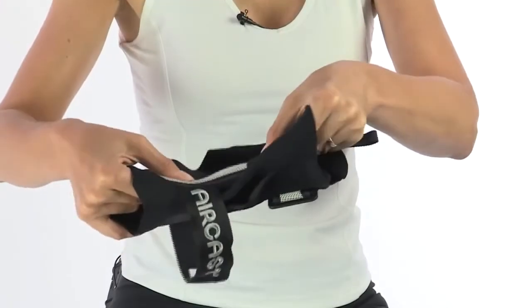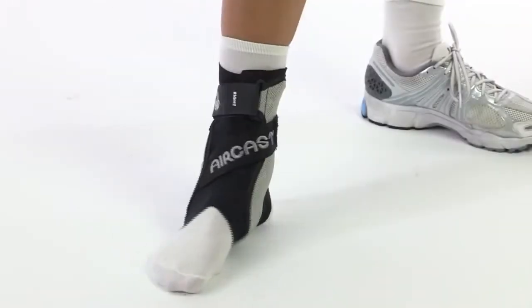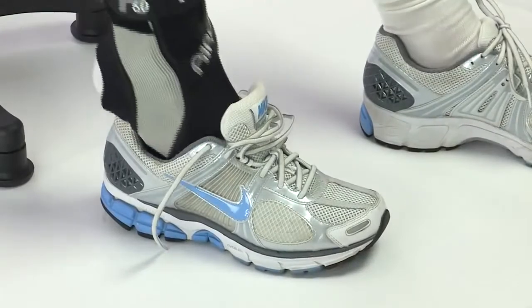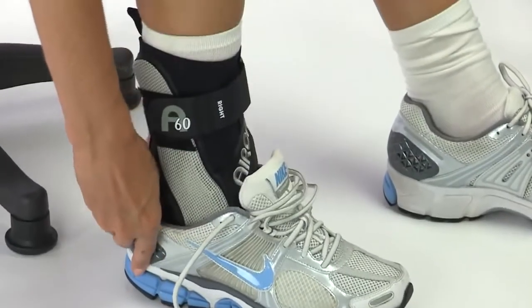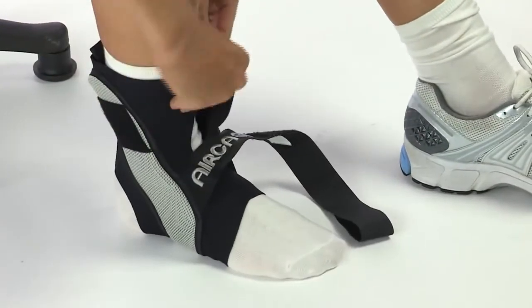Created with the athlete in mind, the Aircast A60 Ankle Brace has a lightweight, molded 60-degree stabilizer that guards against rollovers and helps prevent sprains. The A60 stabilizes both sides of the ankle. It's anatomically designed and streamlined to fit easily in athletic shoes without being bulky. The lightweight, breathable fabric makes the A60 cool and comfortable to wear.